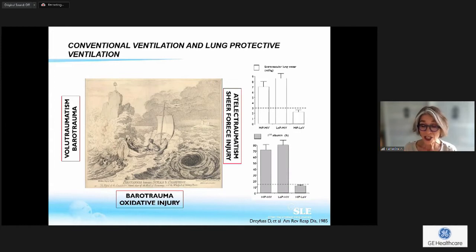So you can imagine that if they open up when you go up on the pressure, and when we went down on the PEEP level, the PEEP wasn't sufficient to maintain my lung open, then again, when I go to the PIP, it's opening up and bursting open again and generating some inflammation. So this atelectrauma will be avoided by setting a proper PEEP. You have to avoid the barotrauma, so not too high pressure.